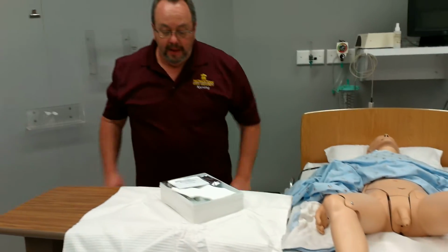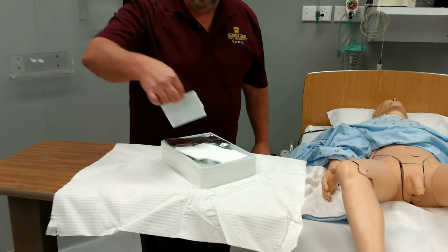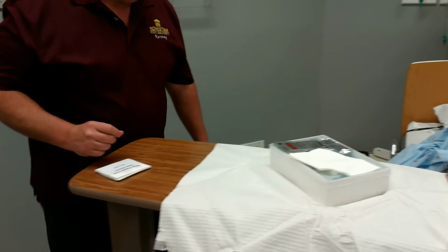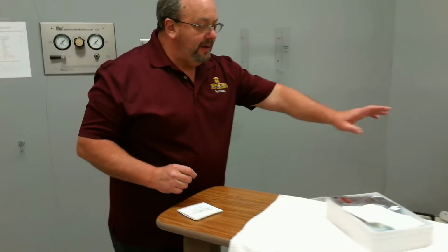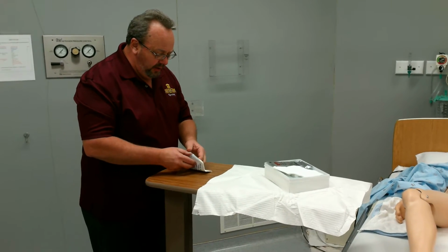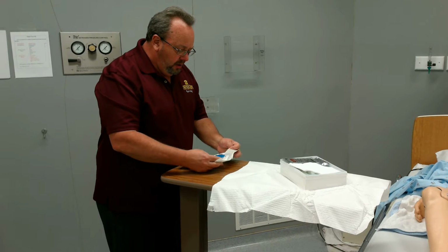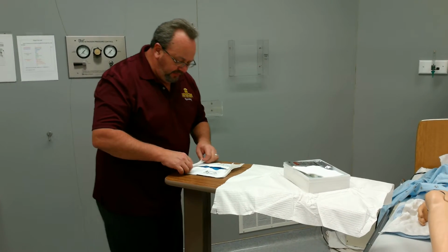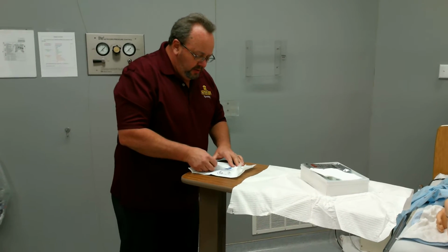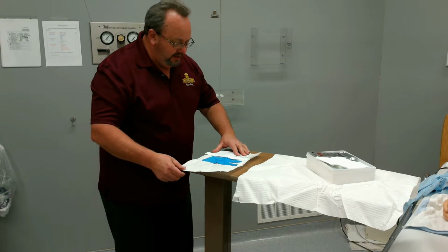Okay, now you see that I have a pair of gloves there. I'm going to pinch those gloves out, put them to the side. Then I'm going to step over this side, making sure I can keep an eye on my patient and on my sterile field, and I'm going to put my sterile gloves on. Opening these sterile, making sure I fold these so that they do not get contaminated, and this does not fold back into my gloves.